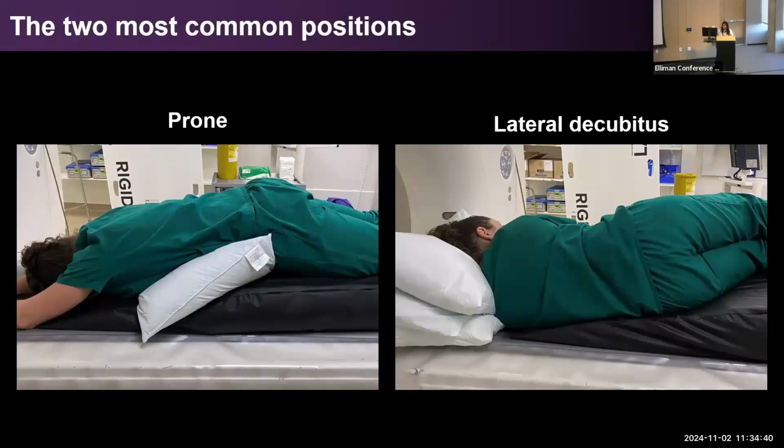And what I tell patients is this feels uncomfortable, especially lying like this for sometimes up to an hour. And I think telling patients that is helpful, because often what my patients say was the worst thing about the procedure was lying in this position for a protracted period of time. So this is often the position that we're using when we're looking for ventral dural tears, and this is often the position we're using when we're looking for fistulas.